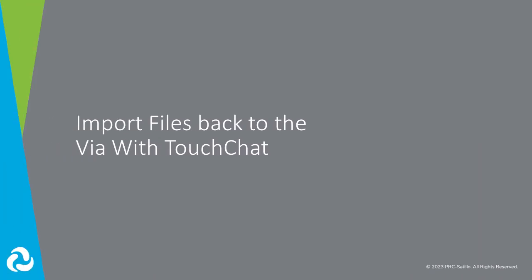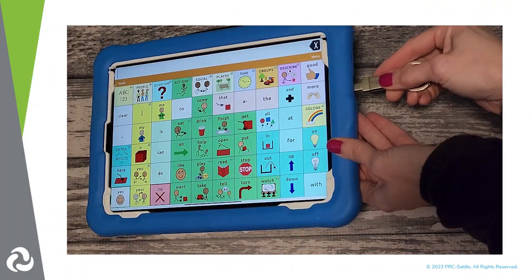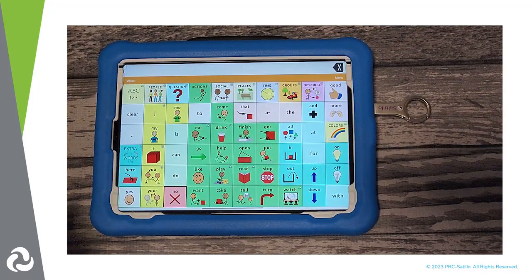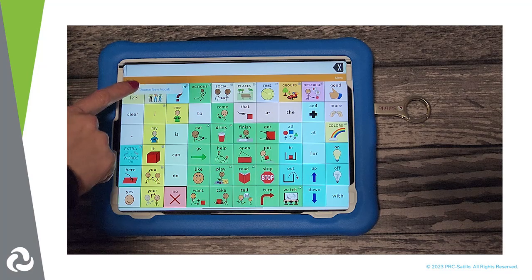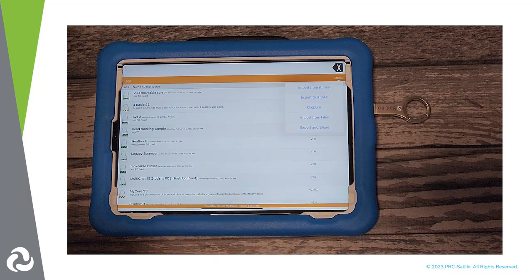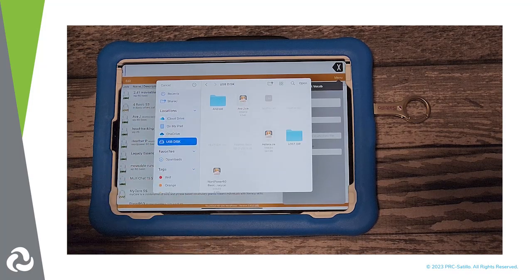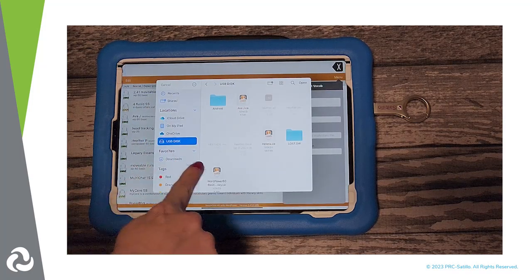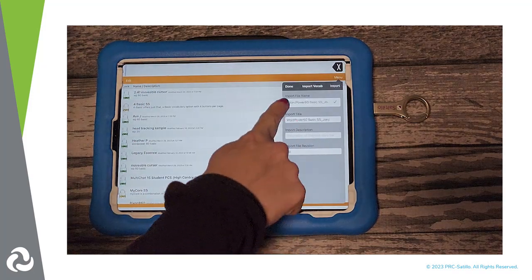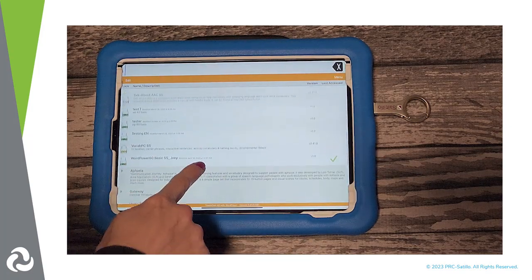Let's take a look at how you import files back onto your Via with TouchChat. Insert the dual USB into the charge port. Tap on Vocab, then choose New Vocab. Tap on Menu, then Import-Export Vocab. Select Import from Files. Select the USB Disk, and then find the file you want to import onto the Via. Select Open. You can rename the file if you would like. Tap on Import. Your customized vocabulary file has now been imported into TouchChat.